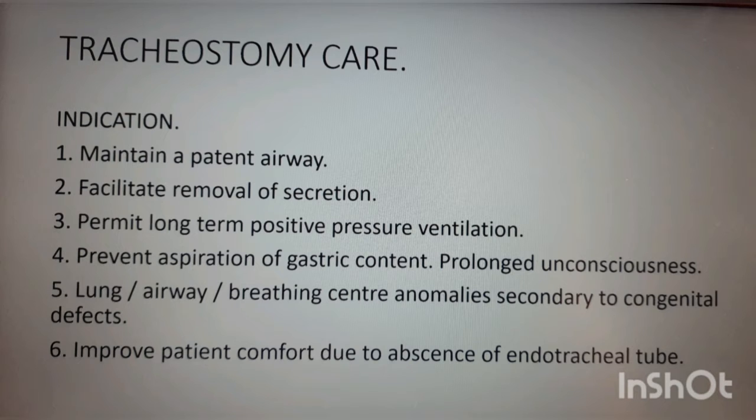Third, to permit long-term positive pressure ventilation in massive chest wall trauma, respiratory failure, high lesion spinal cord injury, prolonged coma, or neuromuscular disease. Fourth, to prevent aspiration of gastric contents in prolonged unconsciousness.